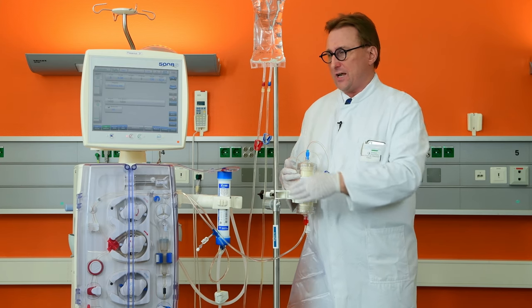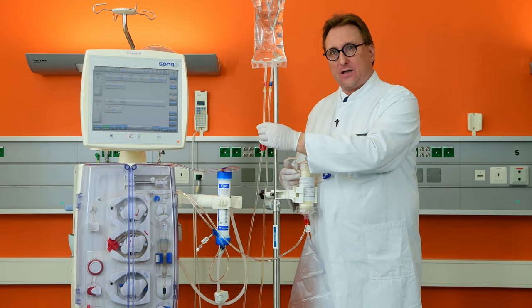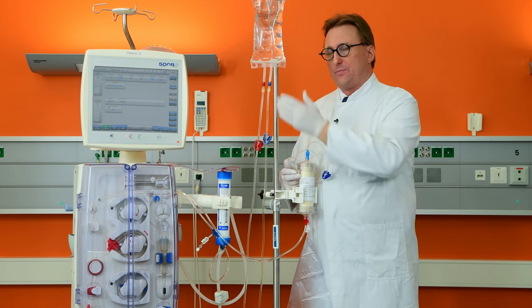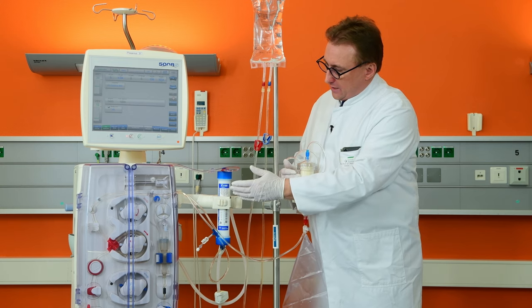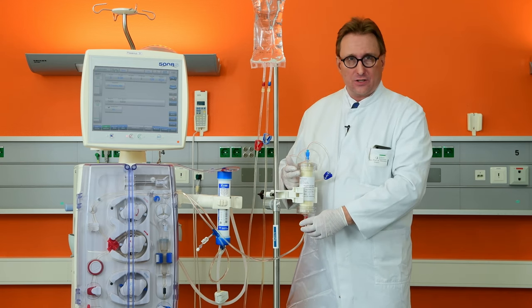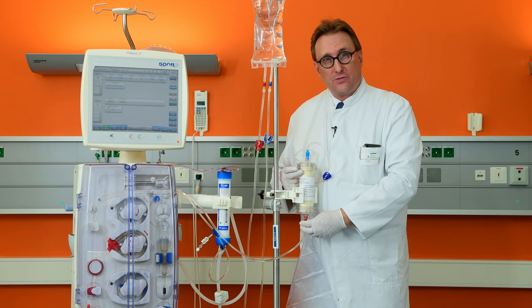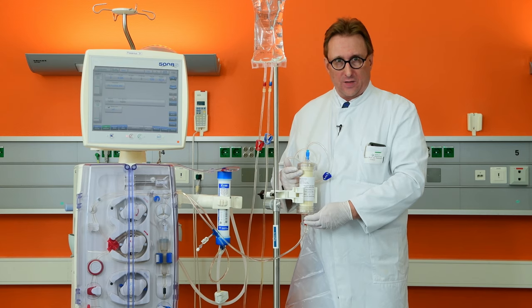The next step is to connect the arterial bloodline — which usually connects to the dialysis catheter — to a bag of normal saline. The arterial bloodline coming from the machine, which usually goes into the dialyzer, is now connected to the inlet port of the Seraph. Before doing that, please de-air the tubing before connecting it to the Seraph.